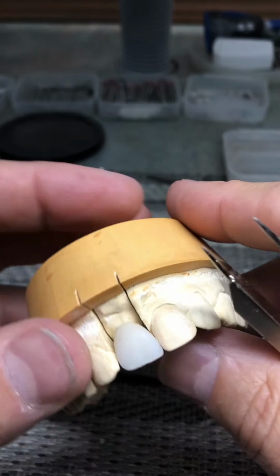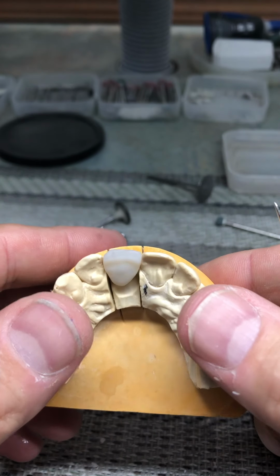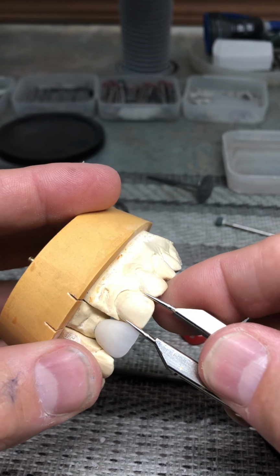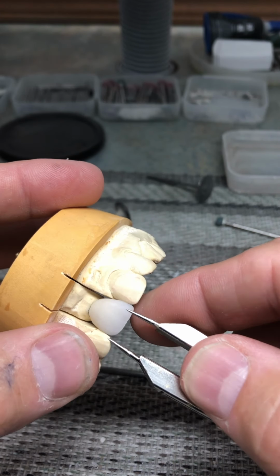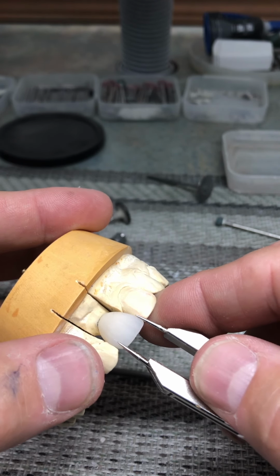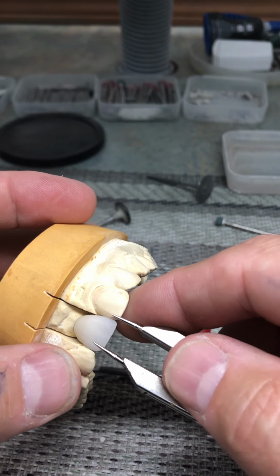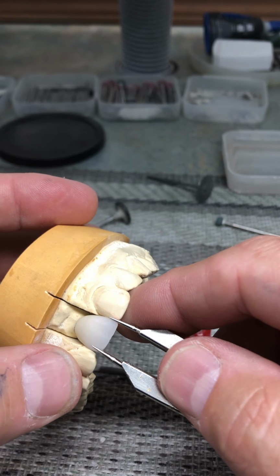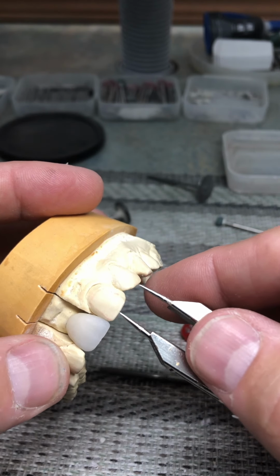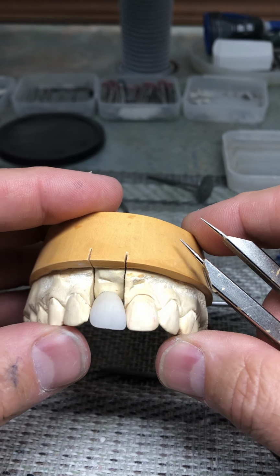So I have a common scenario here where I'm doing a single central, number 8. If I measure the space from number 9 and carry it to number 8, I can see that the space for number 8 is wider than the space for number 9. This is a common scenario, and the way we manage it is by evaluating the line angles and the apparent width as opposed to the actual width.